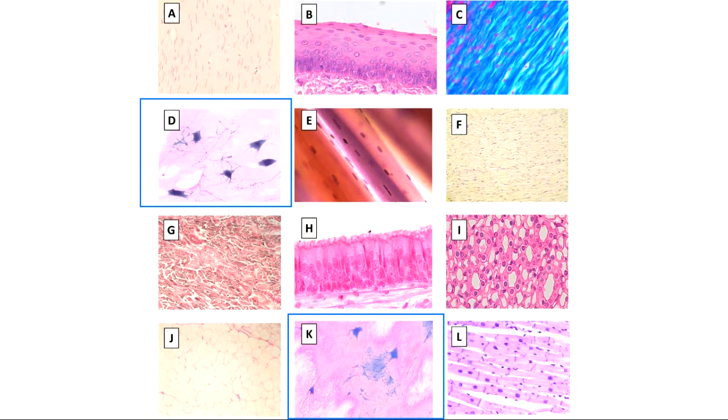When we talk about nervous tissue, one of the best ways to identify it is the colors that I see. In nervous tissue, my cells are always dark in color, dark blue. My cells also have really funky looking shapes. So those cells, we're going to get really good, by the way, in unit number 3 at drawing neurons. Okay, so some of us are saying it's not zooming. Sorry. I'm pointing at D, so if you can mentally zoom, we're looking at D here.